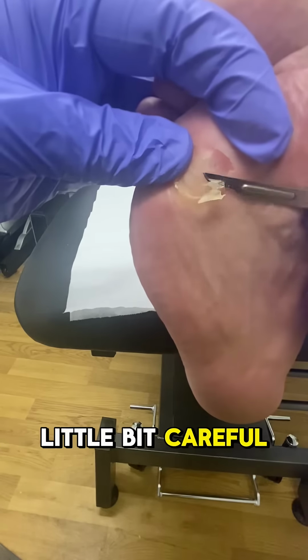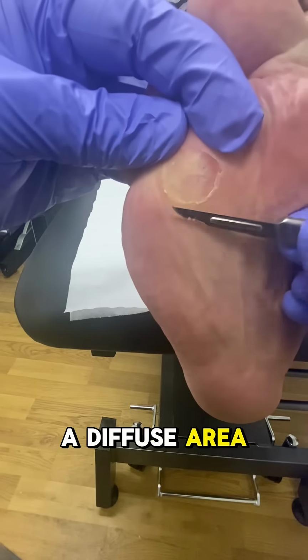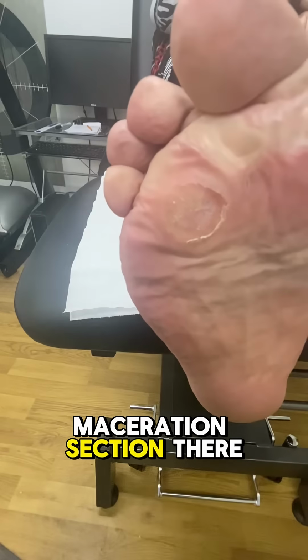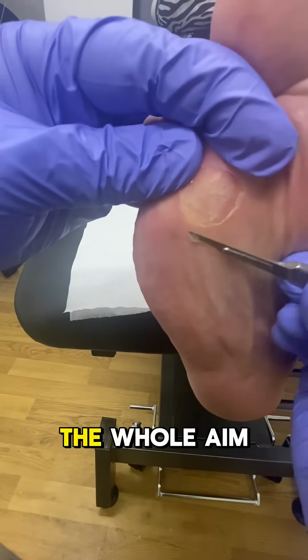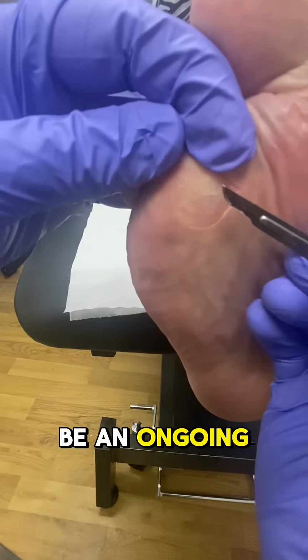Now, we've got to be a little bit careful with this one because it can be hard to spot where the end is, because it's such a diffuse area of callus, and you've got tissue fluid being pushed back out into the skin, causing that white maceration section that you can see. So we've got to make sure we don't cut too far, because the whole aim of what we're trying to do here is just limit the patient's pain and make them more comfortable to walk around. It's going to be an ongoing issue.